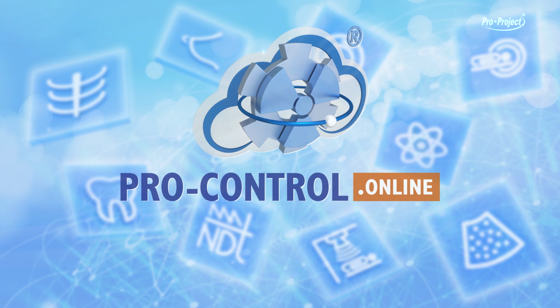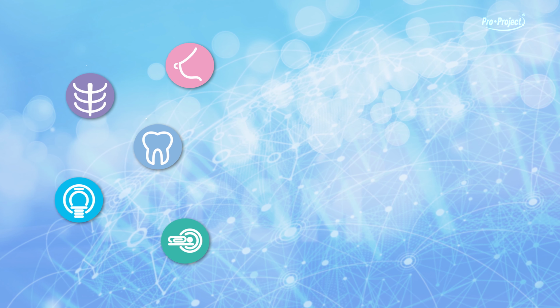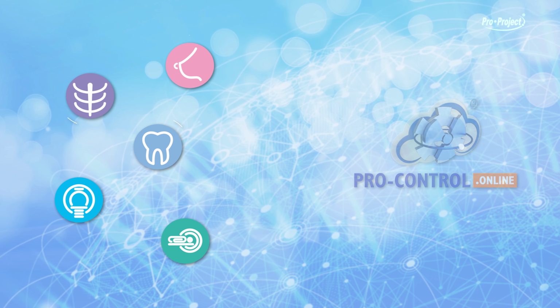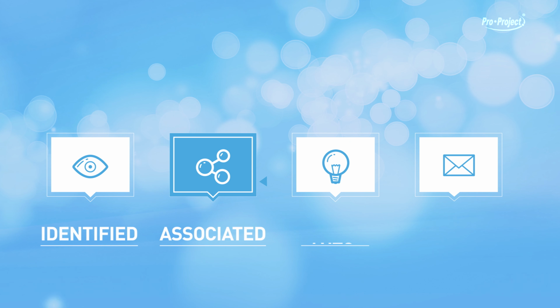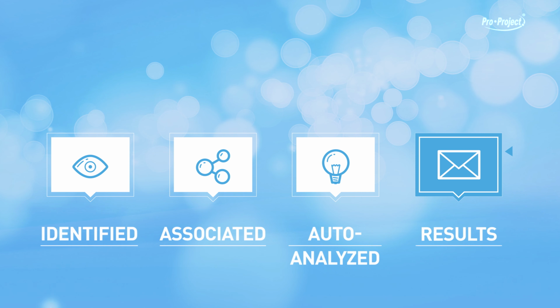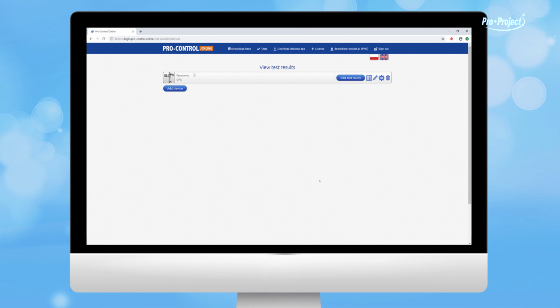Send all acquired images to Pro-Control.online. You have several options. Use full automation and send DICOM images directly from the device to your Pro-Control.online account. While there, images will be automatically identified, associated, and auto-analyzed. You will receive an email about the results of the evaluation, and if all tests are passed, you won't even have to open the app.